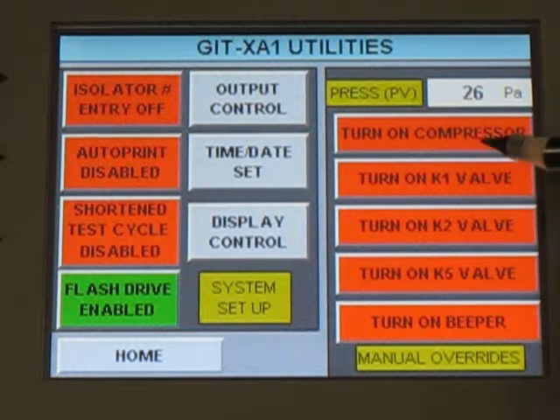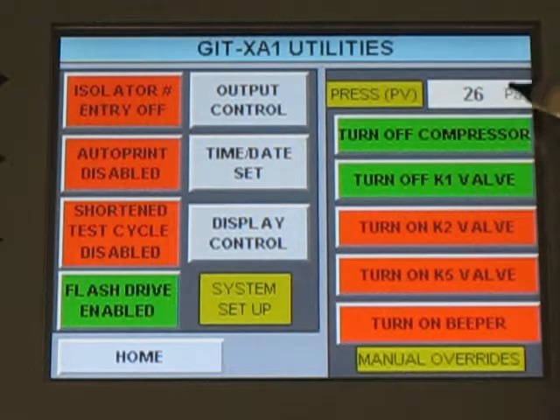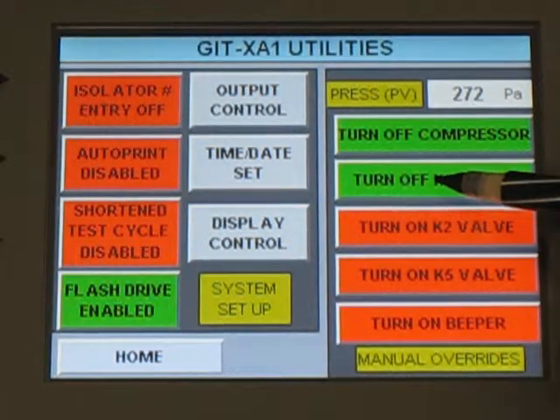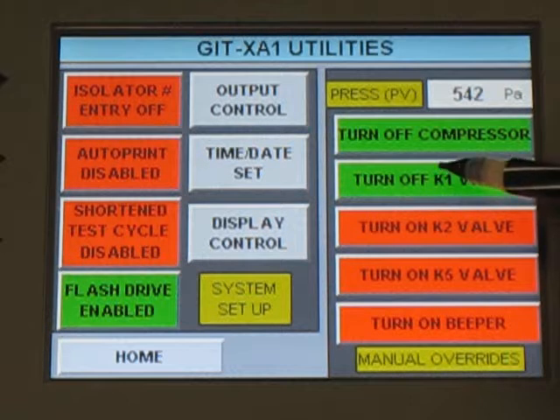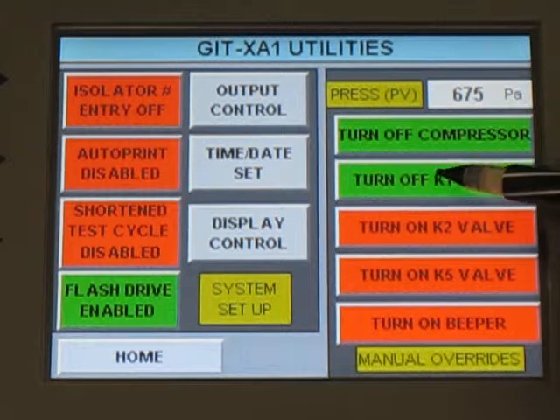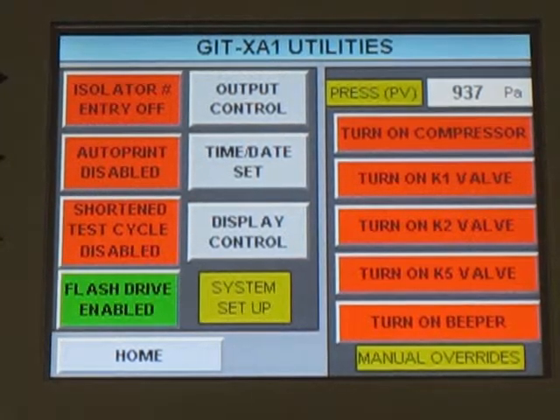So just for demonstration purposes, I can turn on the compressor, I can turn on the inflate valve. You're going to see this number go up as the glove is inflating. That's pretty clear. It's going up, and now we can shut that off. Now the pressure is going to kind of hold. The rubber is stretching right now as we speak.